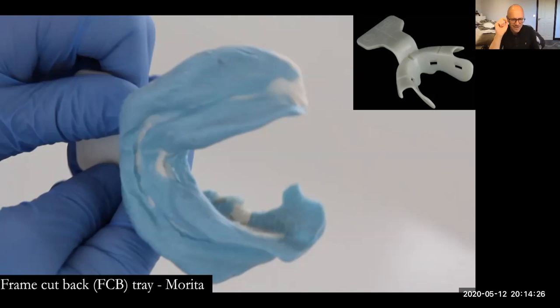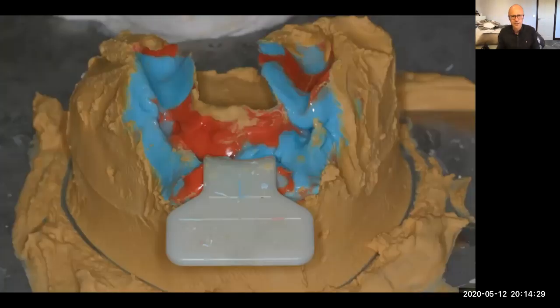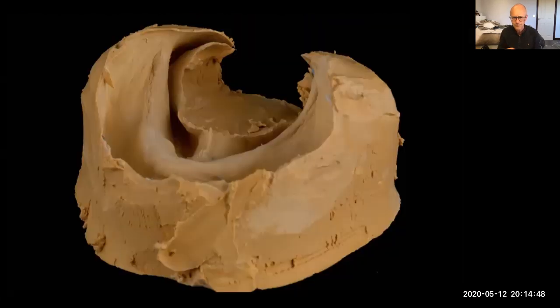Rowan and Sam, my dental technicians, are so careful with it though. And I think it's important that we package it carefully when it's sent to the technician, and then the technician looks after it. They build up a really big chunky bit of plaster, and then carefully fit that in and preserve every detail, so that we have a really superb primary cast. And the whole point of this primary cast is for us to produce a superbly extended special tray. That's the whole point of this.